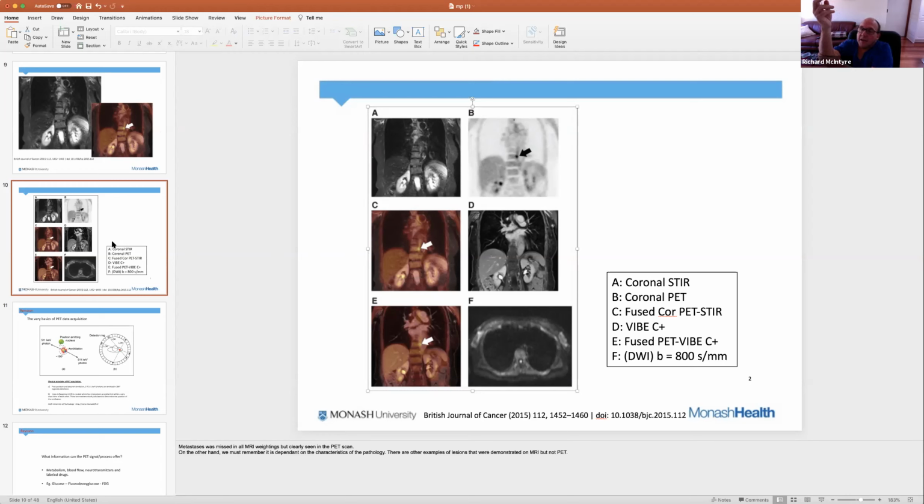So who cares? We can't see that. No matter what we do, we can't see the glucose that we've injected being taken up in my forearm, unless we combine that glucose with a molecule of radiation. So a glucose molecule, a molecule of radiation, then we can follow exactly where that glucose goes in the body. More glucose goes to this muscle, we're going to get a PET signal from that muscle, an increase in radiation from this muscle, because that radiation has been attached to a glucose molecule that's going to go to this muscle. So when we do a scan, you're going to see an increased uptake of glucose within the muscles in my forearm.